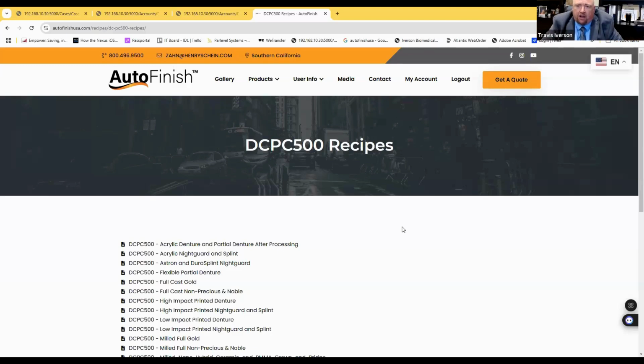When you polish a zirconia crown, it comes with this pearlescence type shade, and it disappears in the mouth like a glazed finish cannot. And so I'm not here to tell you polished is better than glazed or glazed is better than polished, because the bottom line is this: a case presentation, when it shows up at the doctor, there is no question that a glazed finish doesn't look better as a case presentation.